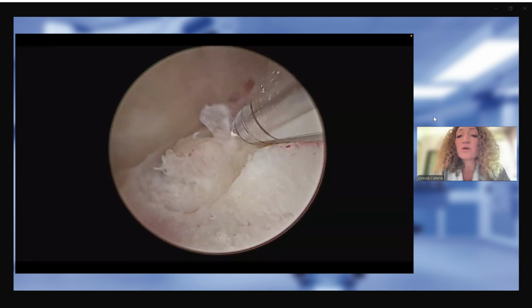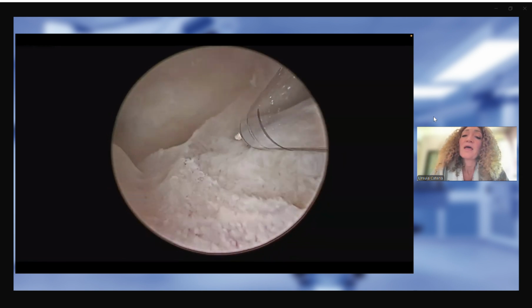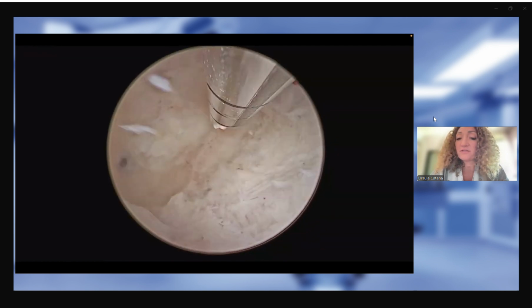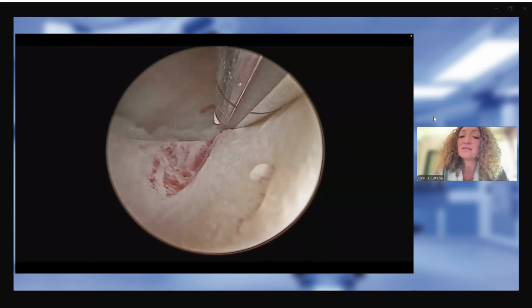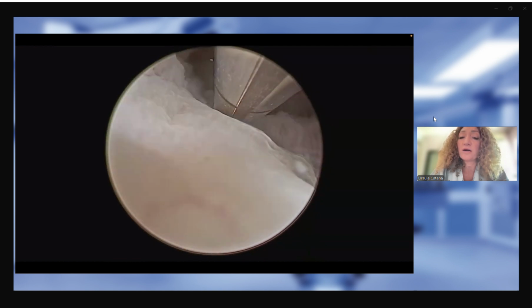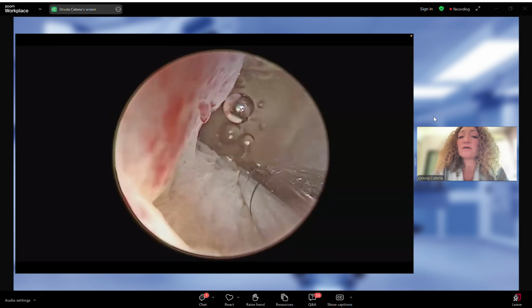With a tissue removal device, we completely remove the thickened endometrium. At the end of the procedure, just after the use of the tissue removal device, we position a levonorgestrel IUD inside the uterus of our patients, and we block the regrowth of atypical polypoid tissue.